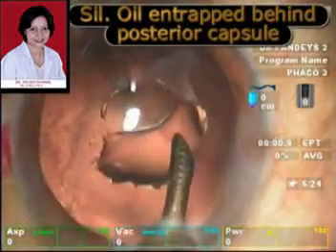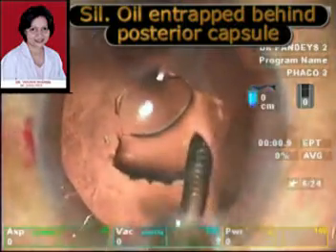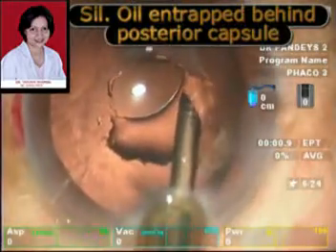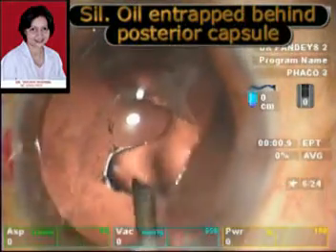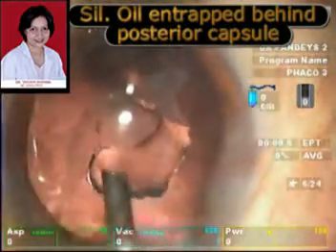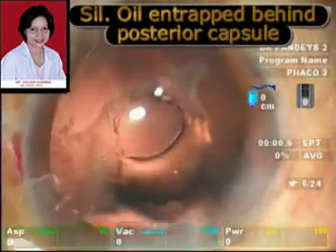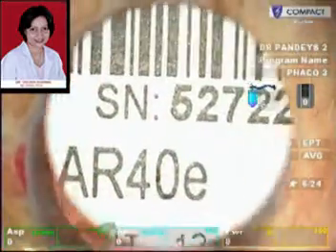The silicone oil that has been entrapped behind the posterior capsule can also be removed by similarly depressing in the area where the silicone oil is coming out.